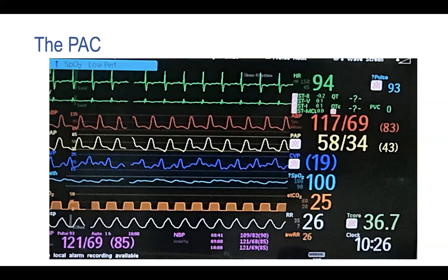I'm showing you a basic screen — this is one of our patients on our Philips monitor. You can see two leads of EKG, arterial pressure, PA pressure, central venous pressure which looks a little unusual — we'll talk more about that next week — plus pulse ox, end tidal CO2, respiratory rate, and other basic information. But our focus today is really looking at the pulmonary artery catheter.